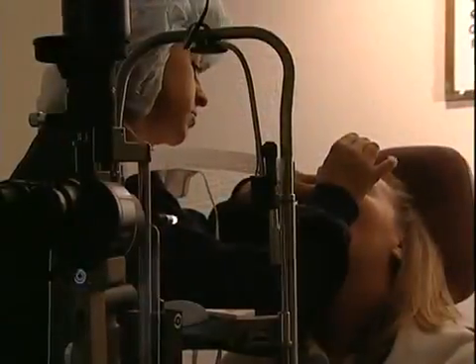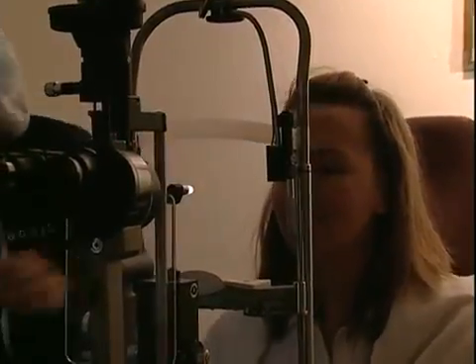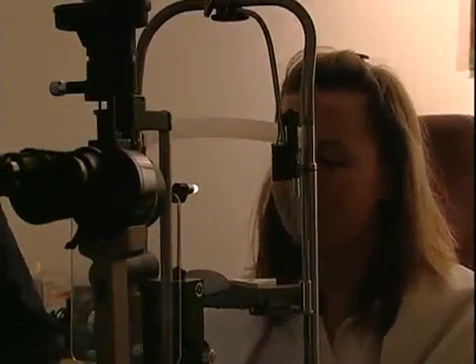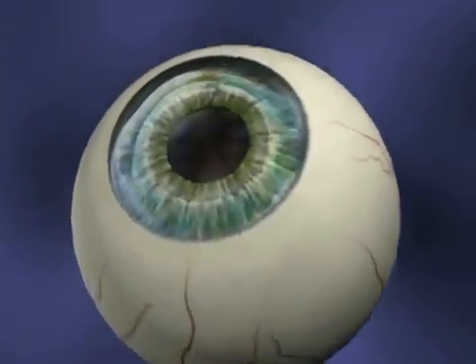On the day of your procedure, prior to surgery, your surgeon will administer topical anesthesia to minimize discomfort. However, you may still feel pressure in your eye. Additionally, you may or may not be given a sedative.